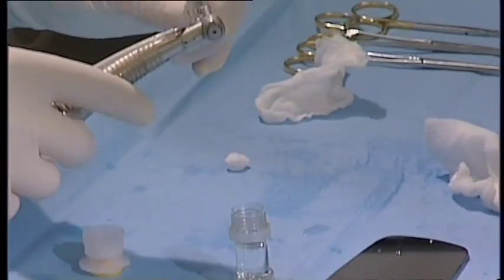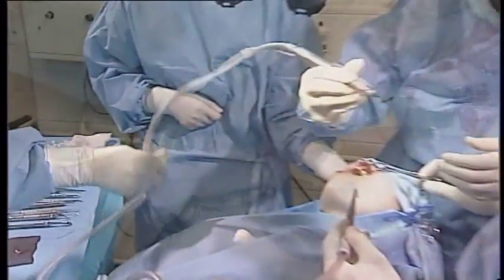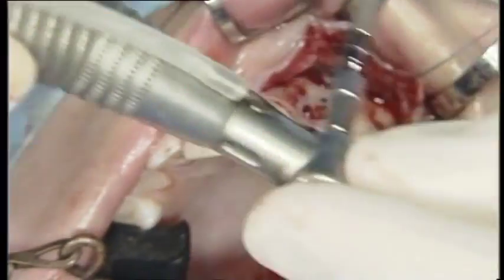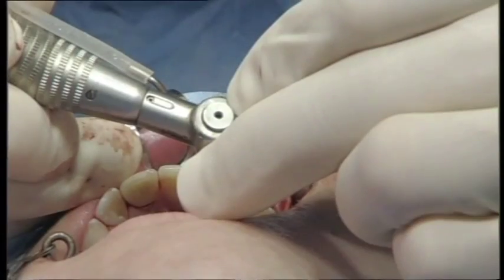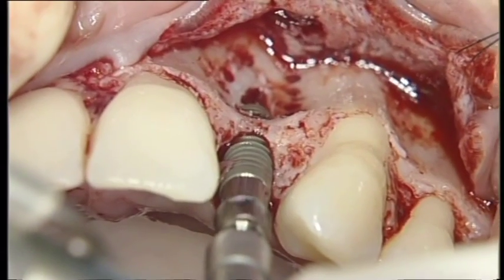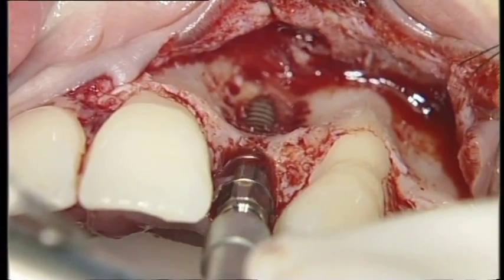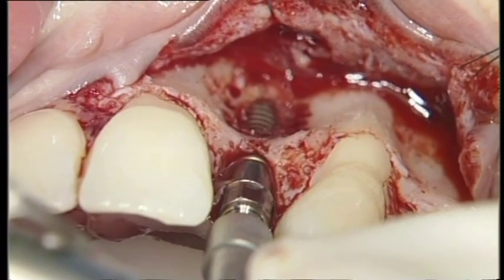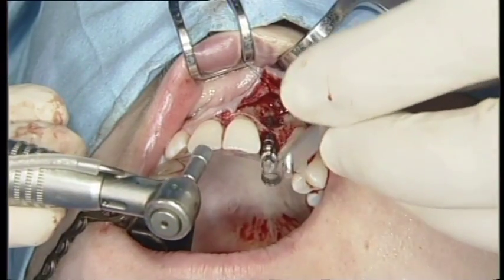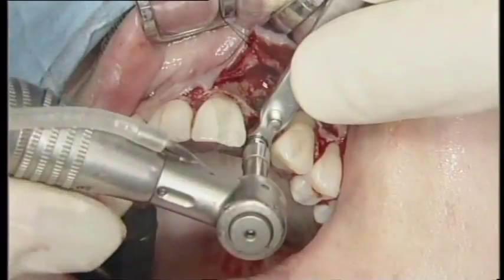A 3.3 millimeter bone-level implant made by Straumann is now selected and mounted on the implant insertion device. The implant with an SL active surface is slowly inserted using a contra-angle handpiece, turning at a speed of 15 RPM without cooling. After the implant reaches the correct insertion depth, the implant insertion device is removed.